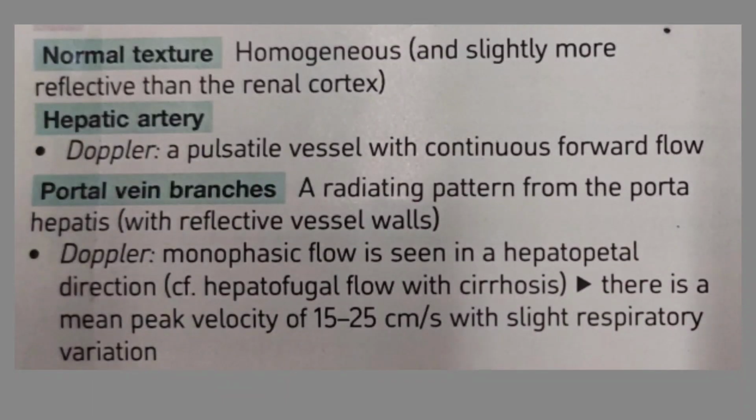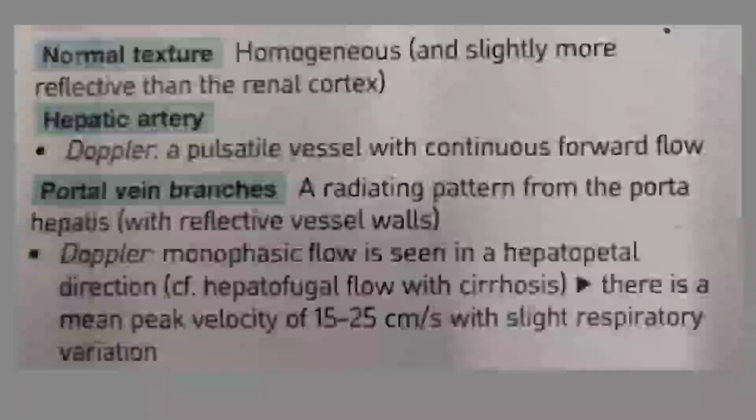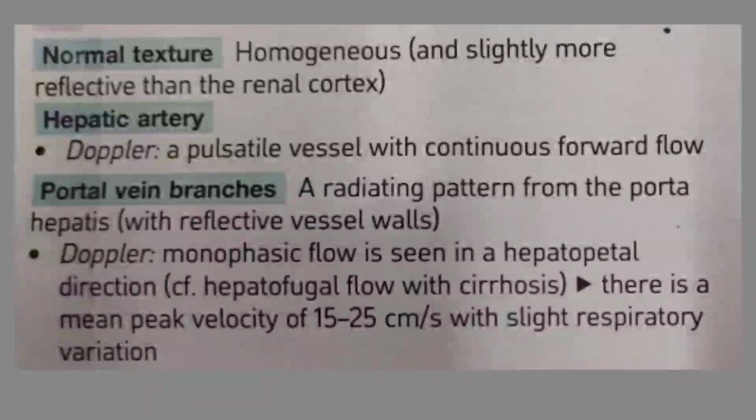For liver imaging techniques, multiple imaging modalities are available. The topmost is ultrasound. Ultrasound is one of the important radiological modalities for the confirmation of the liver and liver pathologies. Therefore it is widely used, easily available, and non-invasive. The liver appears homogeneous on ultrasound imaging.